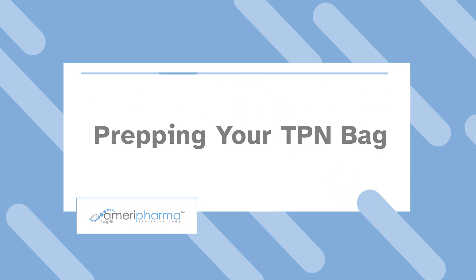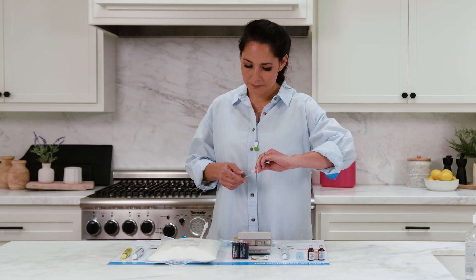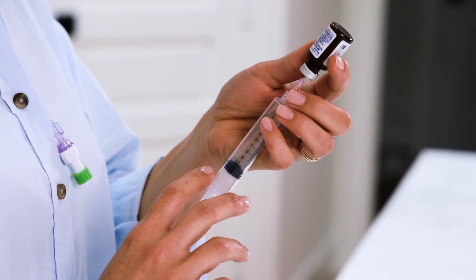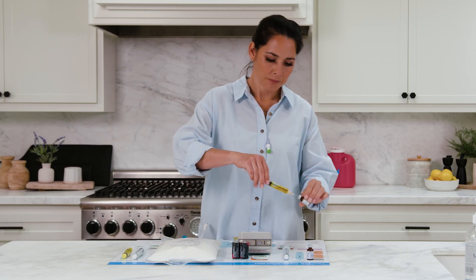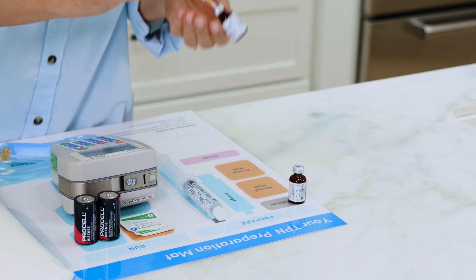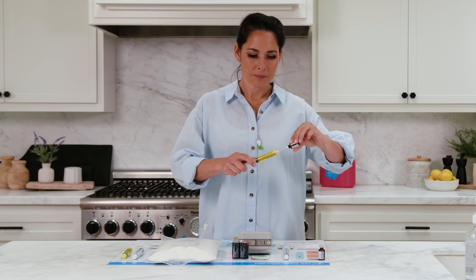Now it's time to prepare your TPN bag. Draw air into the syringe by pulling the plunger. Remove the cap from the needle. With the first vial on the table, insert the syringe into the vial, then turn the syringe and vial upside down and push the air into the vial. Next, draw out the medication in the prescribed amount. Repeat the same steps with the second vial — push air in, turn upside down, and draw the medication out.